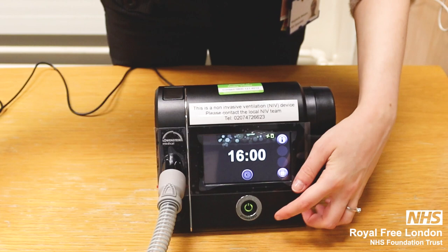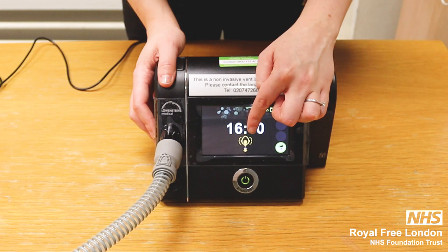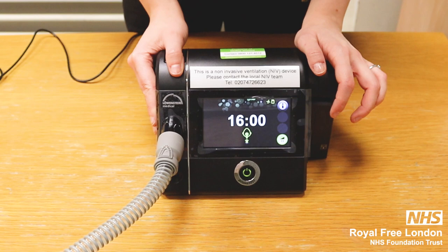To switch on the device, press this button and it will start up. You will see a green face, which means that the mask fit is good. If that face goes orange, it means the fit is not good.